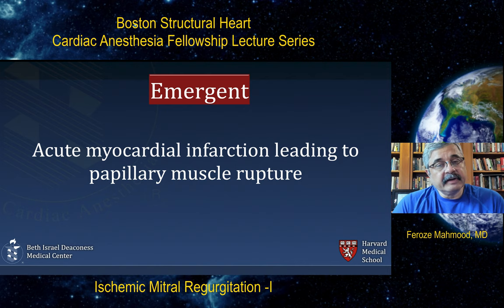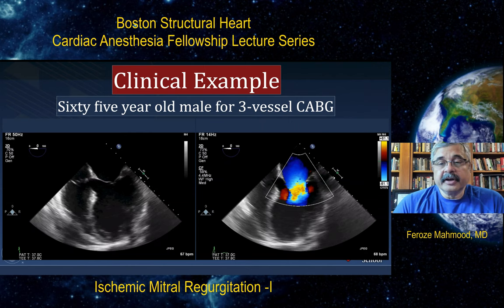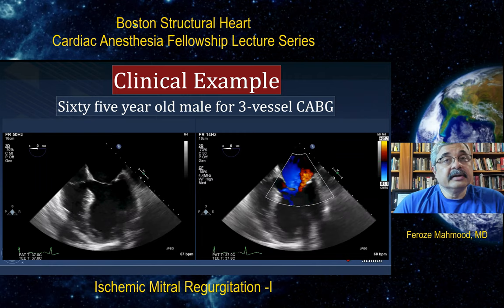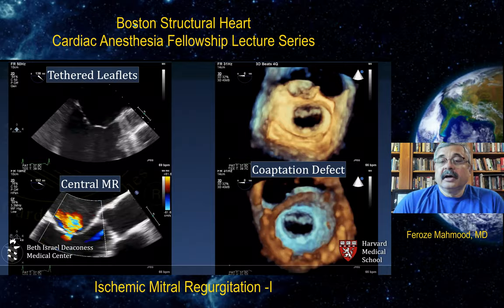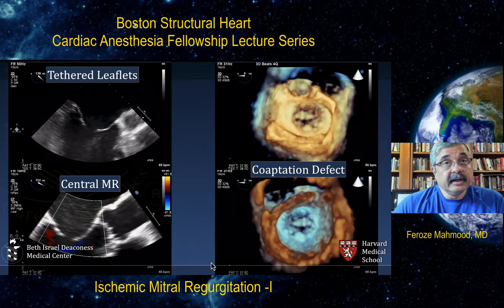Now let's go over a few incidental cases of mitral regurgitation. This is a 65-year-old male for three-vessel coronary artery bypass graft surgery. This is the mid-esophageal four-chamber view. You can see the ventricular function is significantly depressed, and there is some mitral regurgitation with both a central and an eccentric component. As you can see, there are tethered leaflets and central MR. When you look at it in three-dimensional left atrial en face view, it demonstrates a coaptation defect right in the middle of the A2 and P2 scallops.